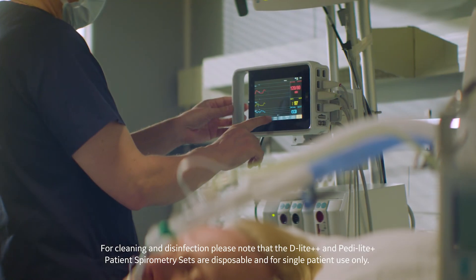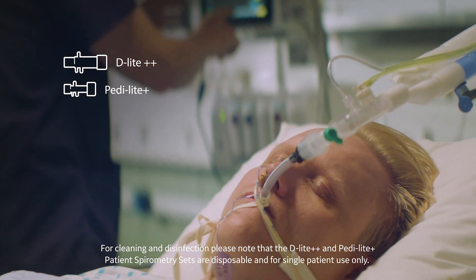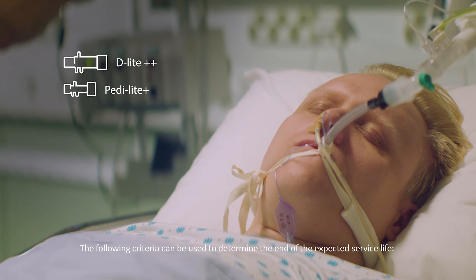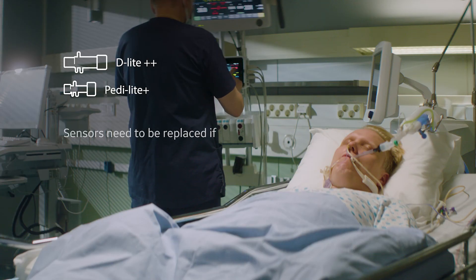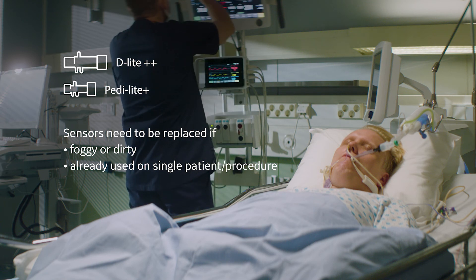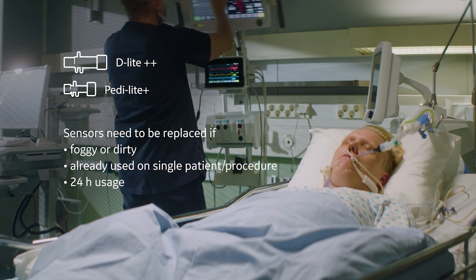For cleaning and disinfection, please note that the D-Lite++ and Pedilite++ patient spirometry sets are disposable and for single patient use only. The following criteria can be used to determine the end of the expected service life: the sensors become foggy or dirty; they have been used on a single patient during a single procedure; or 24 hours have elapsed since the spirometry set was taken into use.